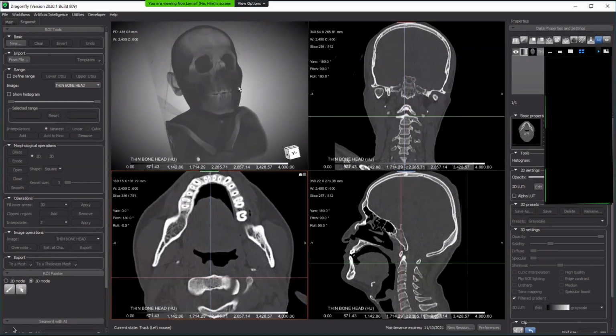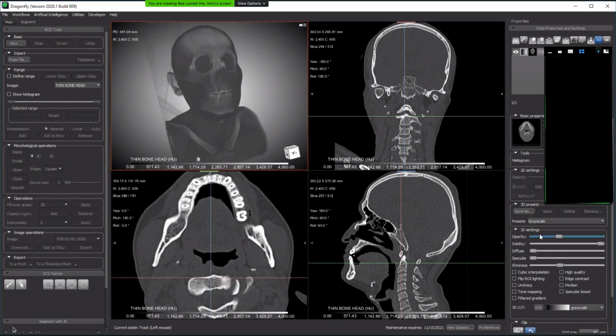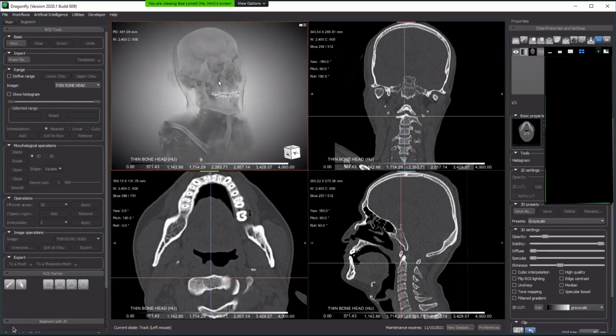So yeah, I'm working with CT scans, and I want to do segmentation to extract just the maxilla and its individual parts. And also I want to segment the nasal cavity. I haven't worked really in any of this, just trying with the tutorials on YouTube, playing around with the scans.